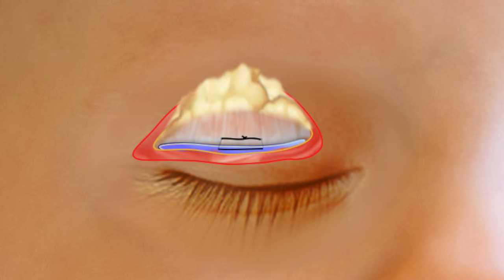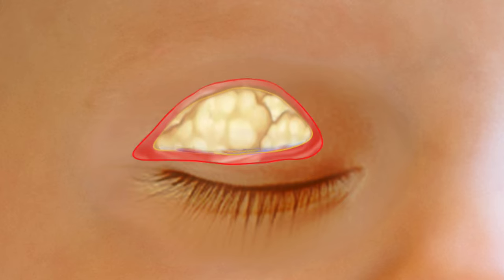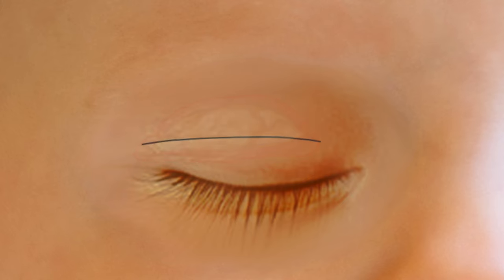Other sutures may be placed at this time. After the fat is placed back in normal position, the skin is closed.